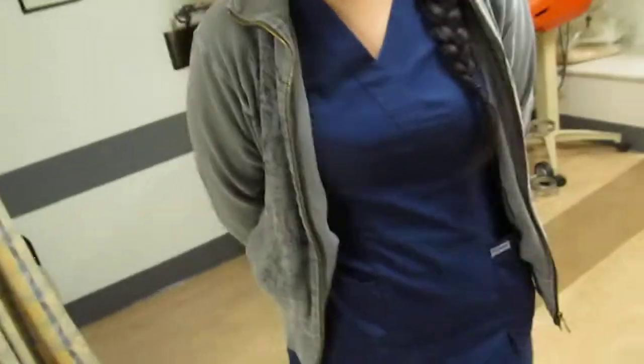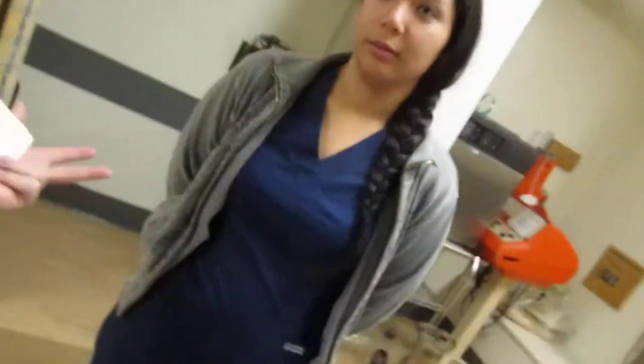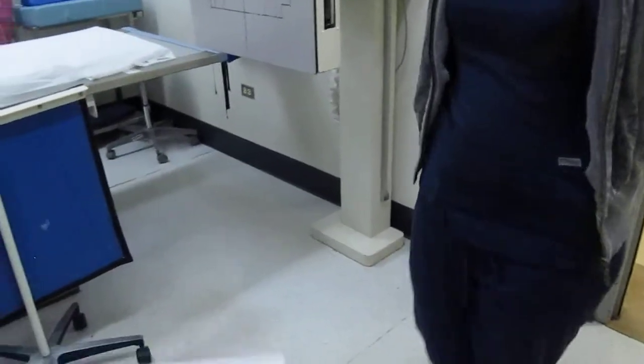And I would ask my patient if she could change into a gown. So I'd get a gown and ask to change into the gown. Remove everything from your waist up, including your bra if it has any underwire, any jewelry, your necklace or anything. And after she changes, we would go back to the room. So I would close the door for privacy.